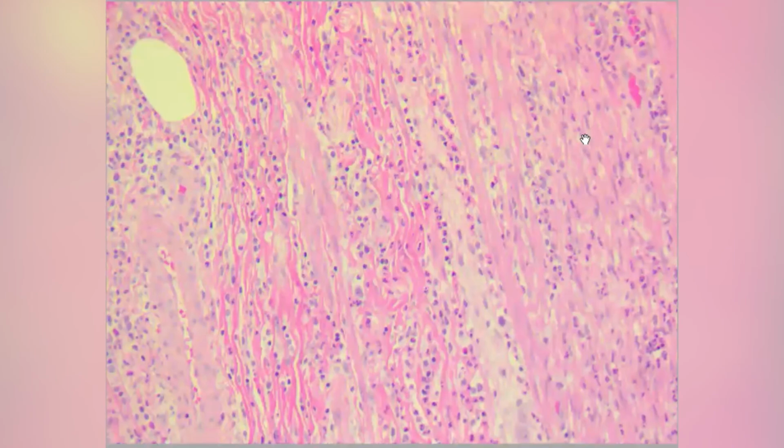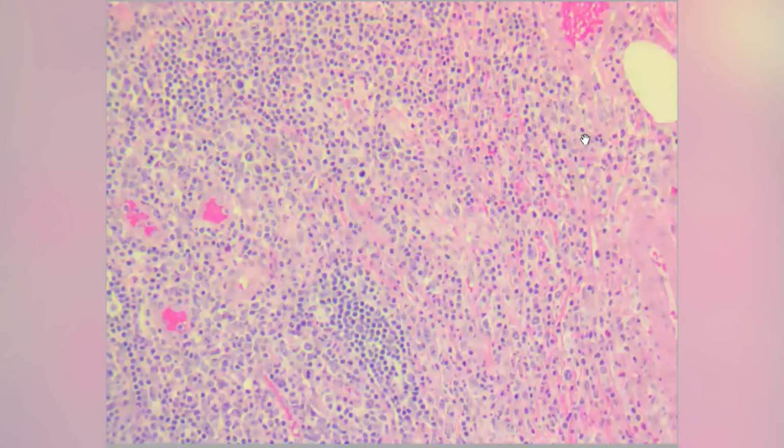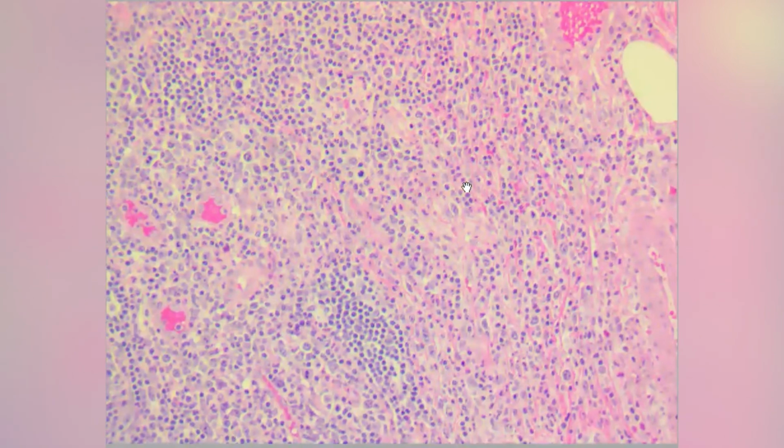Let's go into the lamina propria and submucosa, and here again you will see neutrophils present. So this is acute appendicitis. But the most important is the muscularis propria.